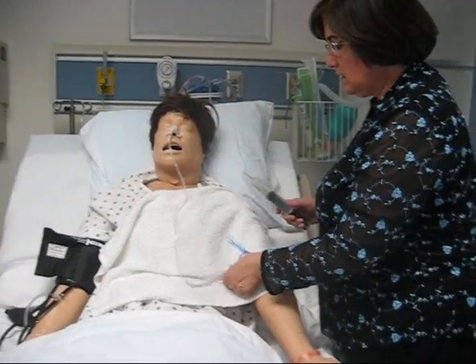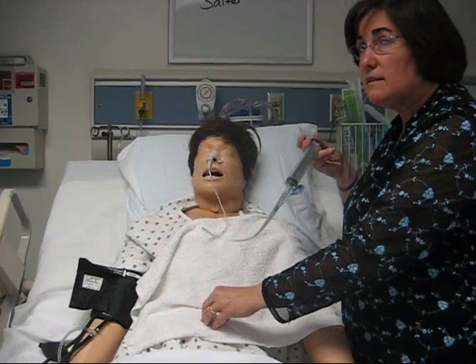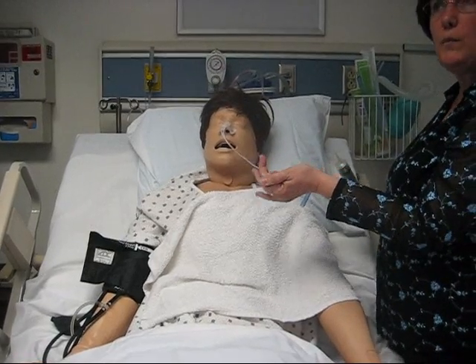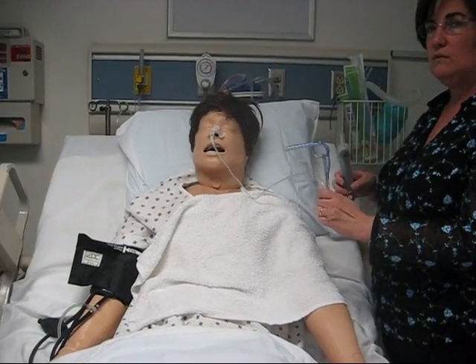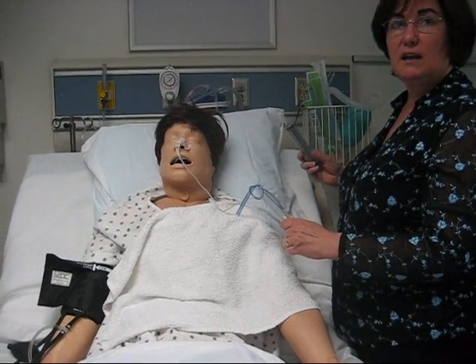So I could do the insufflation, which is not my favorite. It takes a second for the air to get there. I could pull out gastric contents and look. I usually crimp the tube when it's open, because if they cough, sneeze, whatever, they could blow stuff right up this tube straight on you. You'll only do that once. Anyway, and then you can put this on the litmus paper and check, all right.